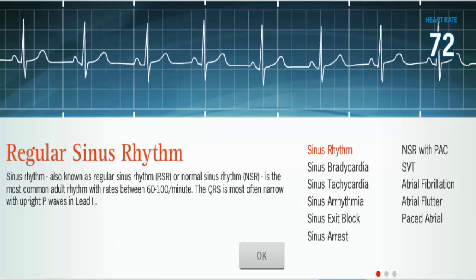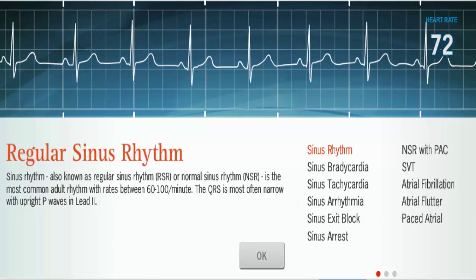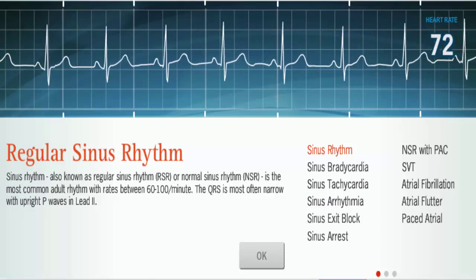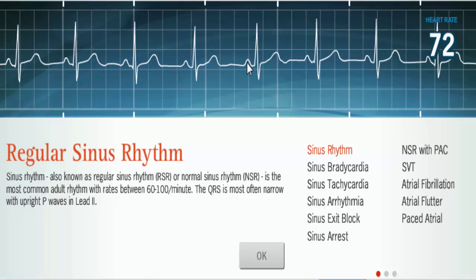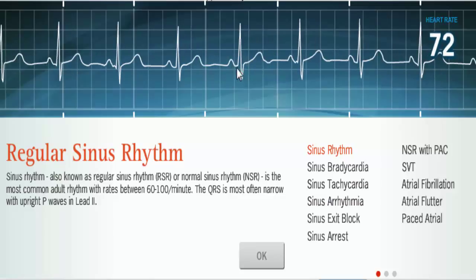Let's talk about some of the atrial rhythms. We'll start with sinus rhythm. In a sinus rhythm, you have your P wave, your Q, R, S, and T. The P wave indicates that the beat is originating from the sinoatrial node, and the QRS represents ventricular depolarization, with the T being ventricular repolarization.